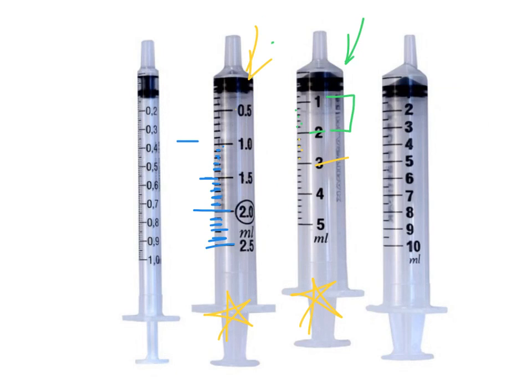So that's the big thing I see on these syringes, is knowing the difference between those two types of syringes. The biggest way to see that difference, and let me get some of these markings off of here so it's not so crazy looking, is again, look at the distance between your whole numbers. On this syringe, there are 9 dashes in between 1 and 2, counting the 1.5 that's already marked off for us.